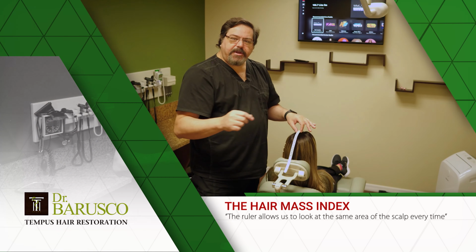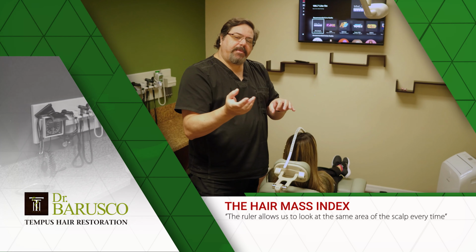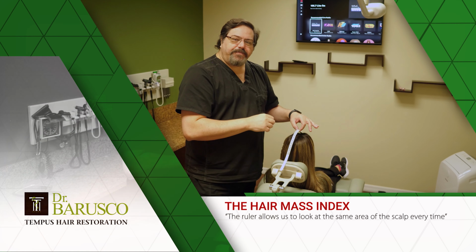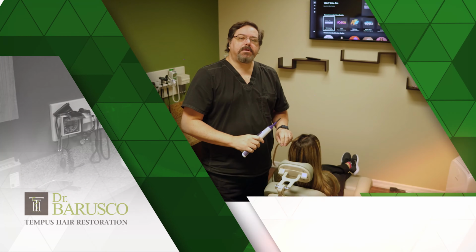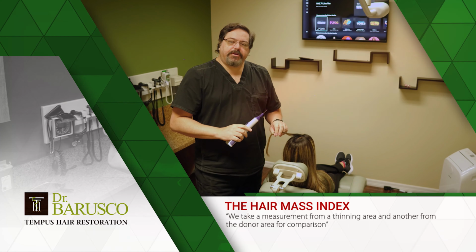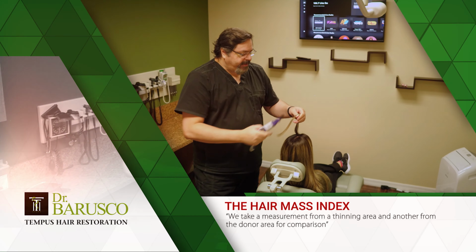And then there's a little template. We separate the hairs in that spot. So every time we come back and do it again on her, it'll be the same number here on the ruler. So we've been measuring the same hair. So using that template, we selected the area we're going to measure here. And so I've separated and we put a little elastic band here.